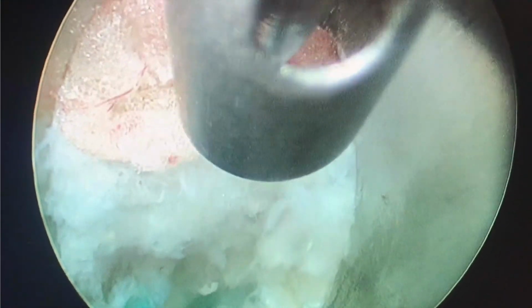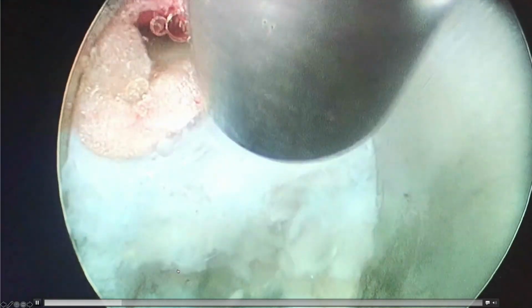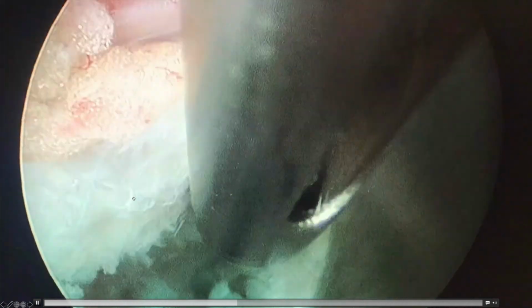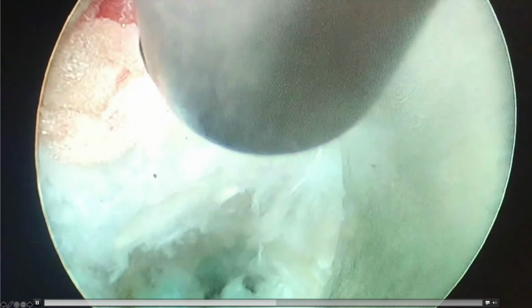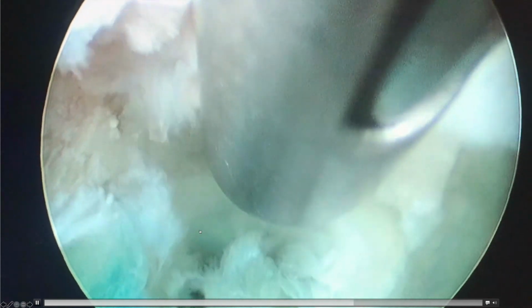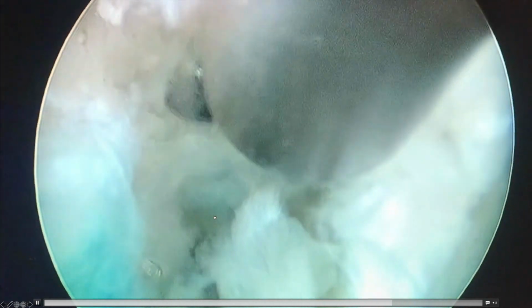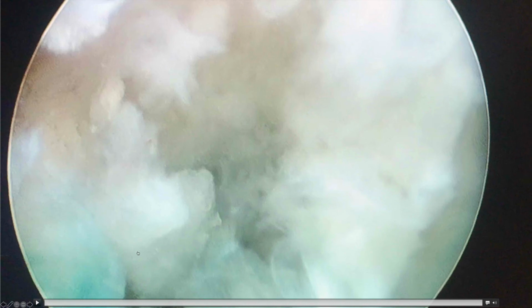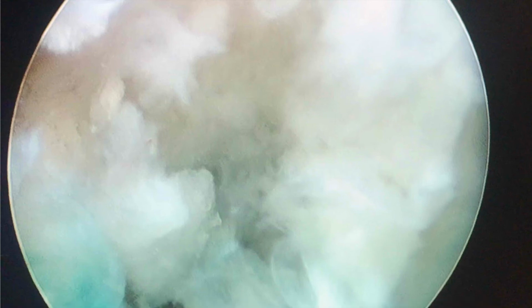Now here's an example. This is the back of the annulus. Now I'm going to show you a fragment of why people say my back goes out. So I'm kind of mobilizing a little fragment here, and you're going to see this fragment right below here. You see my little white arrow here. So watch this. I'm just mobilizing something, but watch the size of this huge fragment come out here. There, to see the blue, the stain, there's the fragment coming right out. There you can see it just popped out of the annular tear. So when people say, wow, my back goes out, this is why: fragments like this are moving in and out of the wrong position.